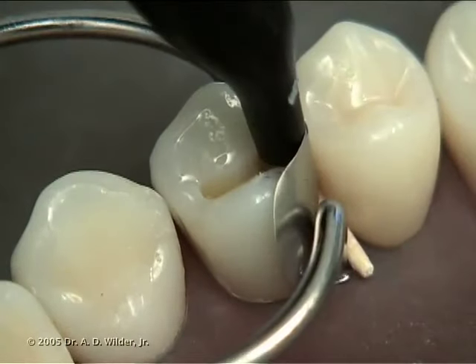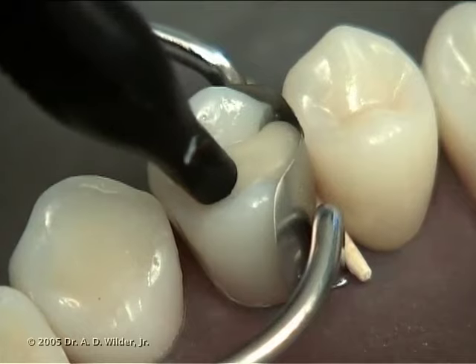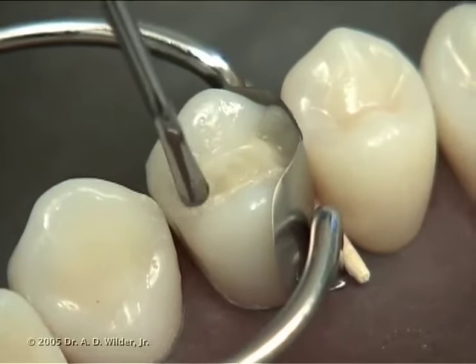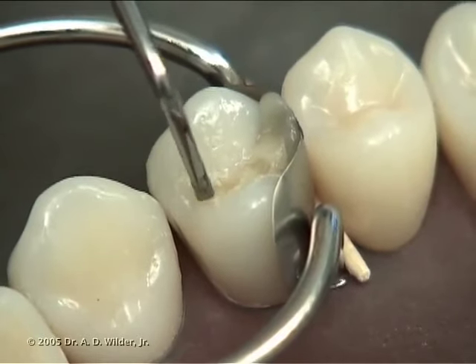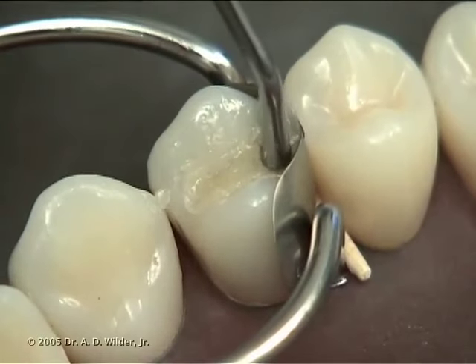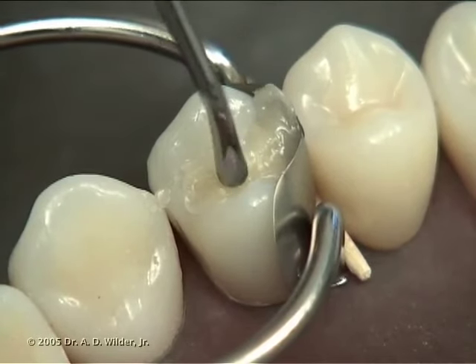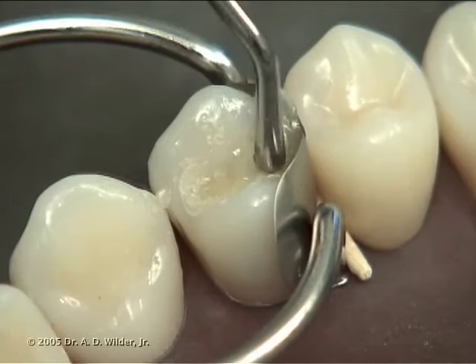Cure this first layer for about 20 seconds, or as directed by the manufacturer. Continue this process until you have enough composite built up to restore the natural anatomy of the tooth. Take special care to re-establish the marginal ridge area against the matrix band, contouring this final layer of composite with a ball burnisher or any composite instrument.